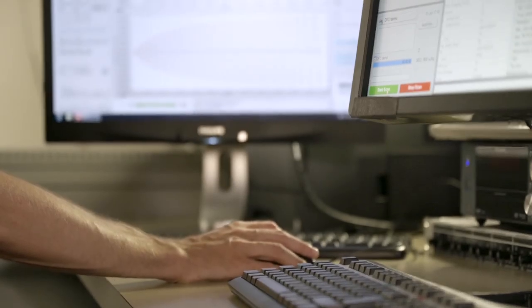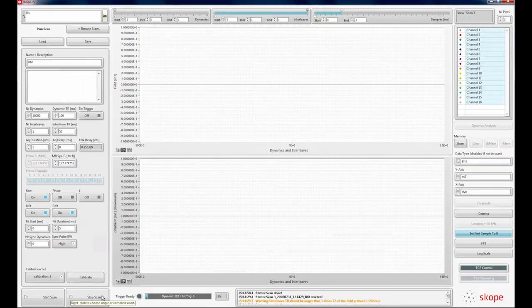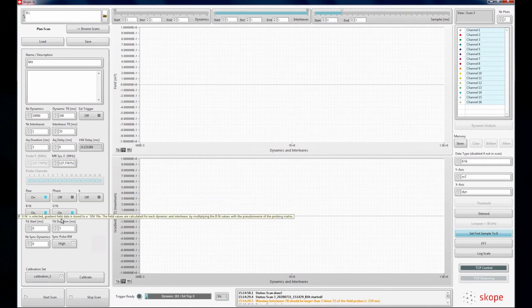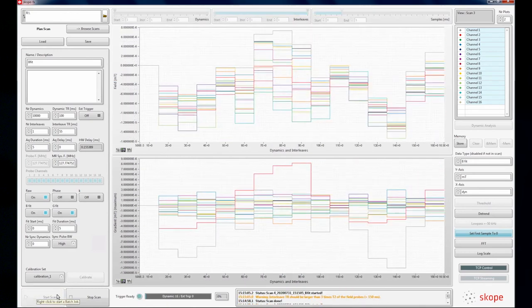In addition to monitoring system dynamics, we can investigate the influence of external fields on the scanner's field. We can set up the scope system to continuously sample the magnetic field without a sequence running. Let's start the acquisition in a free running mode and demonstrate how you can see the field fluctuate in response to a variety of sources.